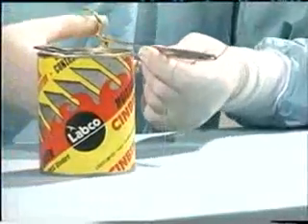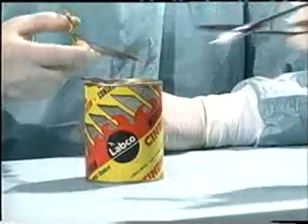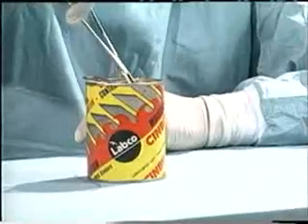When you have finished with the needle, do not lay it down on the patient or on the table, but pick it up, and whenever possible, dispose of it by cutting off the thread and placing it in the sharps bin provided.